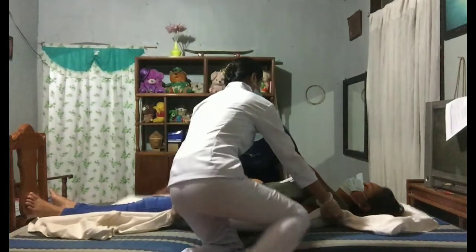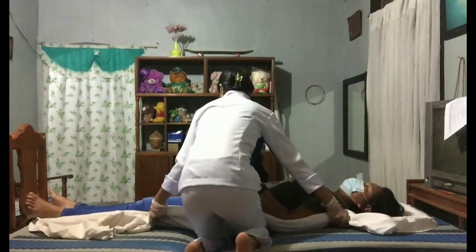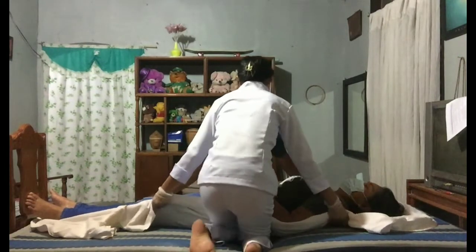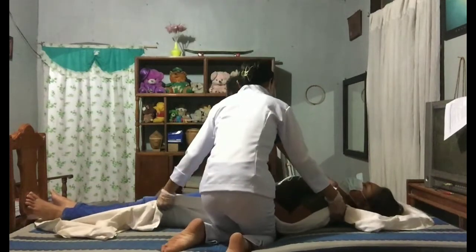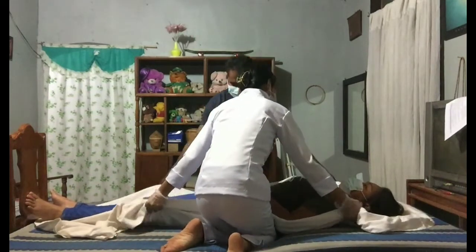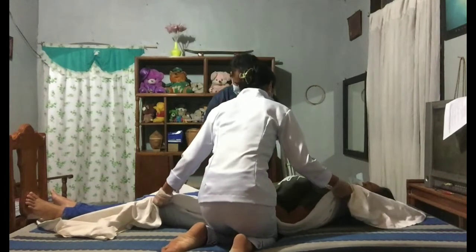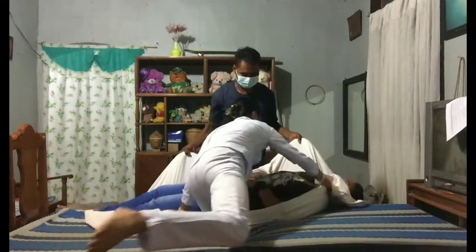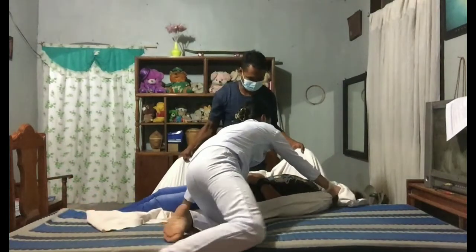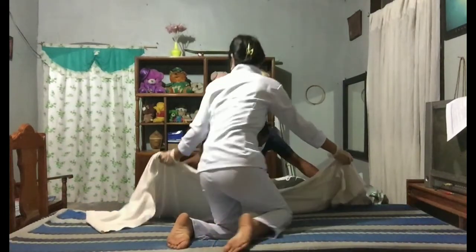Lock the wheels on both the stretcher and the bed. Have the client fold arms against the chest and move chin to chest. Let the assistant stand across the middle of the stretcher and grasp the other rolled end of the sheet by the client's head and lower hip area. Climb onto the mattress beside the hips and buttocks of the client and grasp the rolled sheet by the shoulder and hip area.